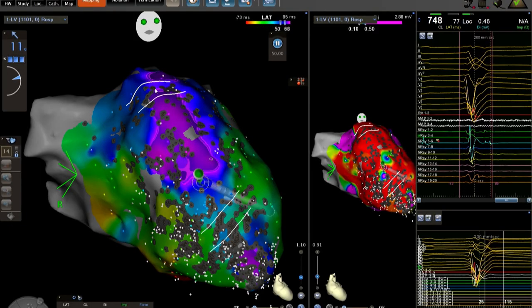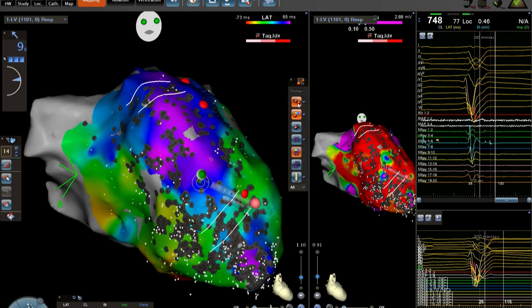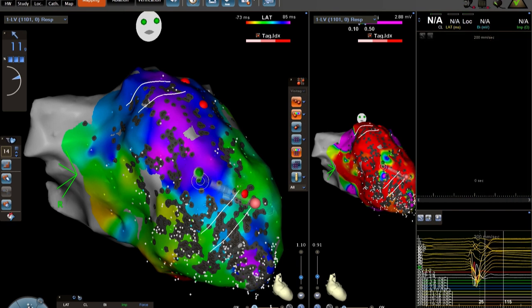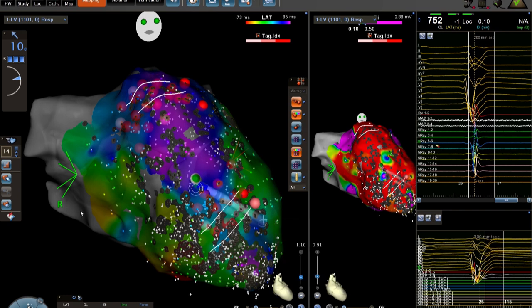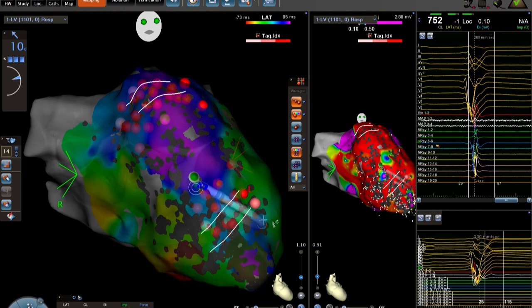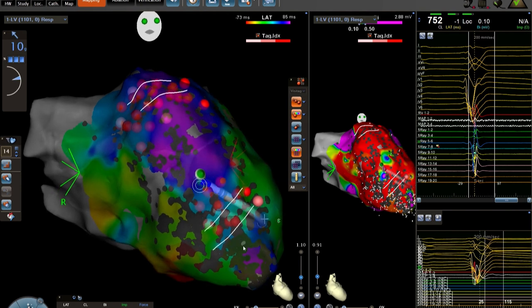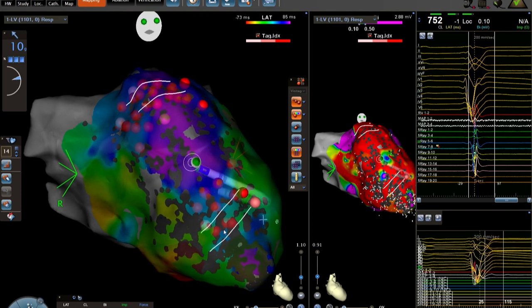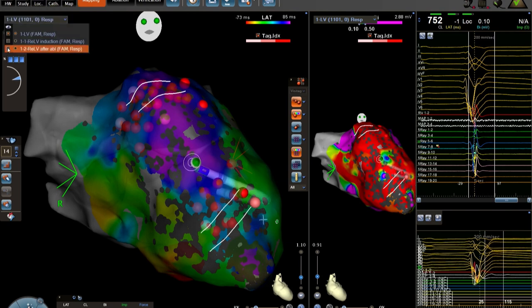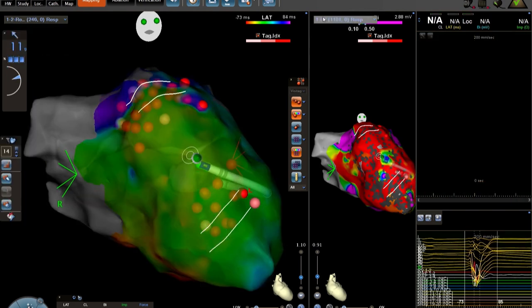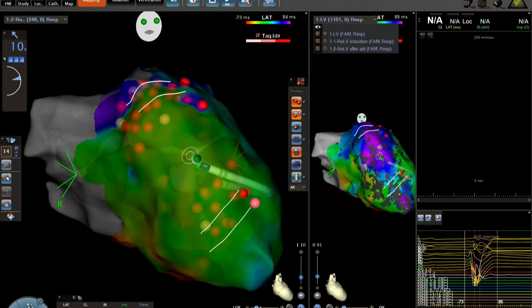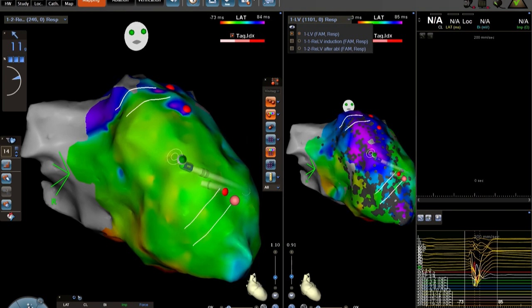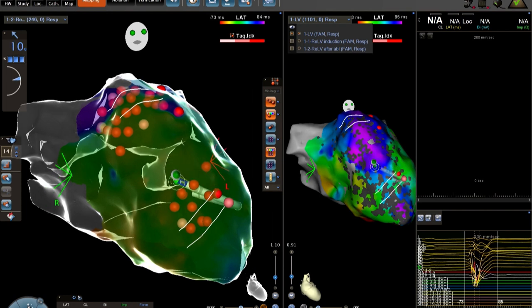The ablation points are in the bottom channel and upper channel. The total ablation was about seven to seven and a half minutes. On ICE we were making a lesion that was almost pre-pop, and impedance during ablation was relatively low in the 100 range, so we didn't stay very long. Then we remapped with the ablation and pentarray catheter.